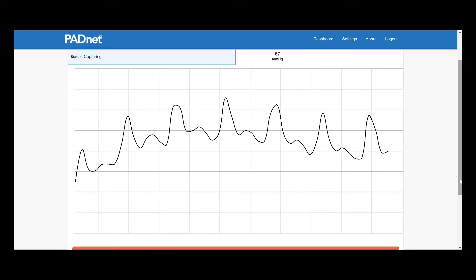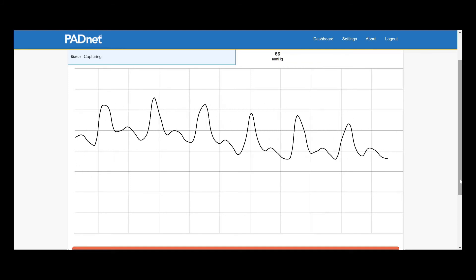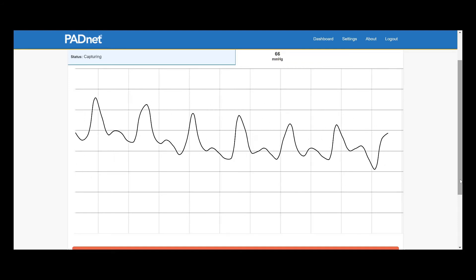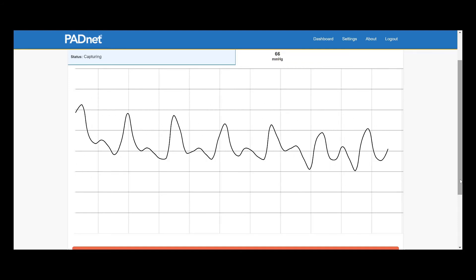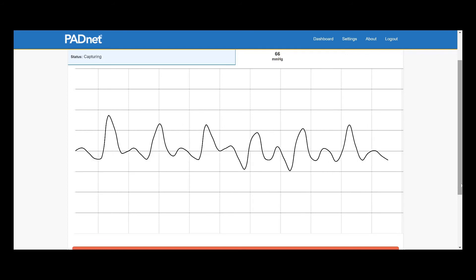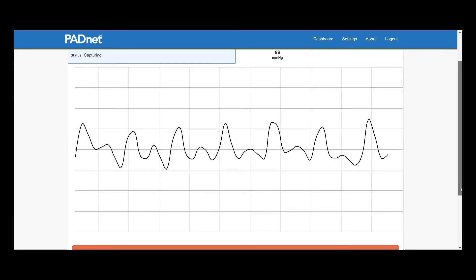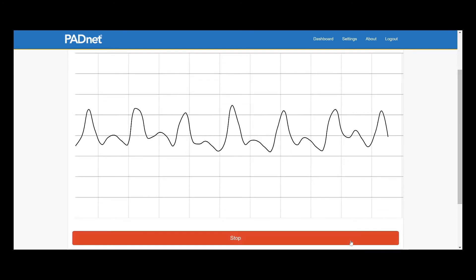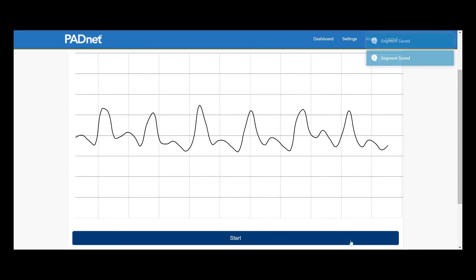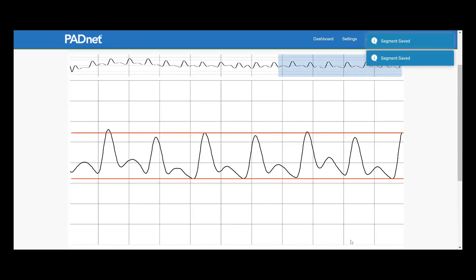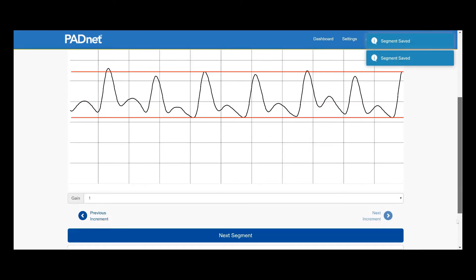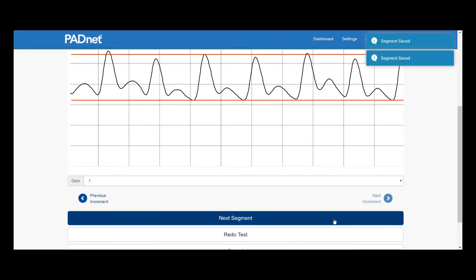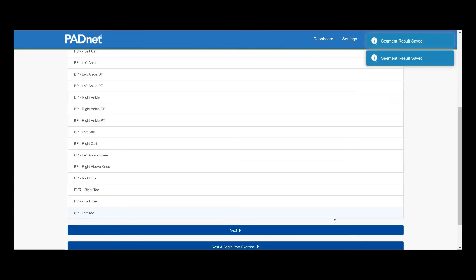Again, we'll let the waves stabilize as you see that they, as a whole, begin to rise and fall over the span of the graph. Once they've centered and once we get our consistent waves, we can go ahead and click Stop, look at our amplitude lines, make sure we're happy, and we'll click Next Segment.